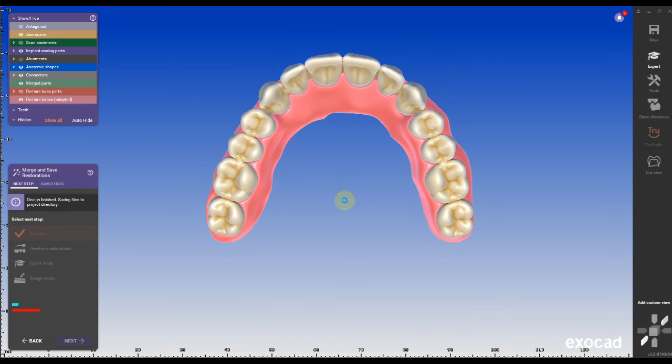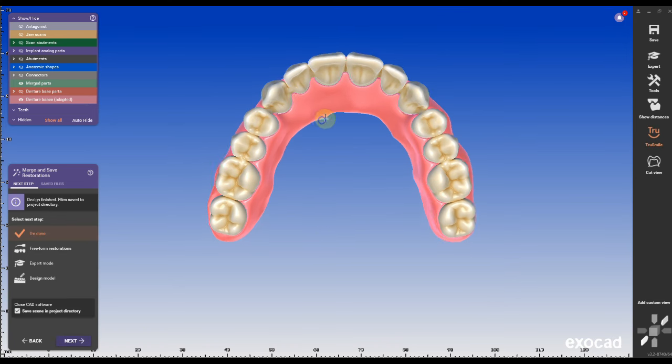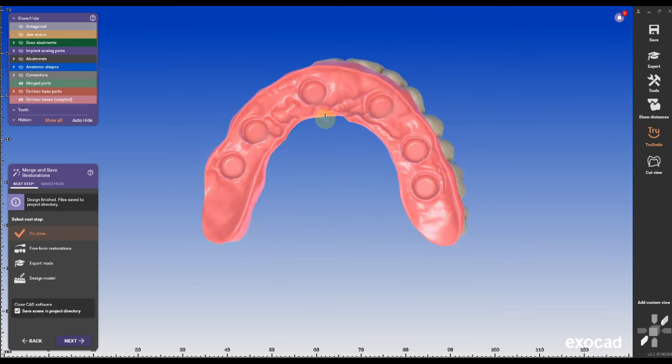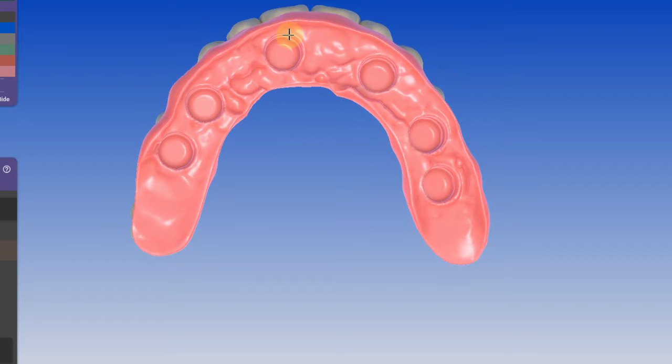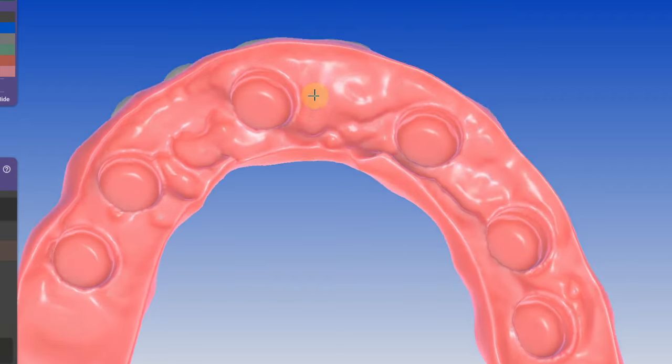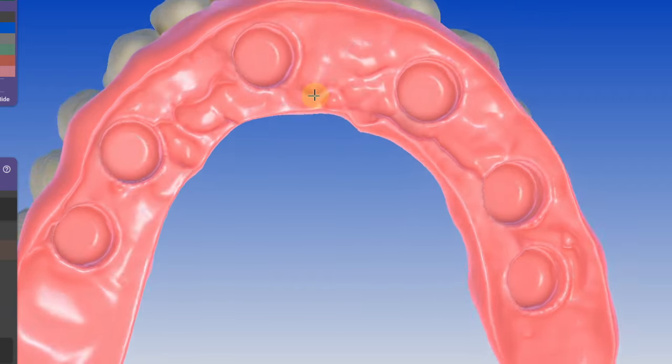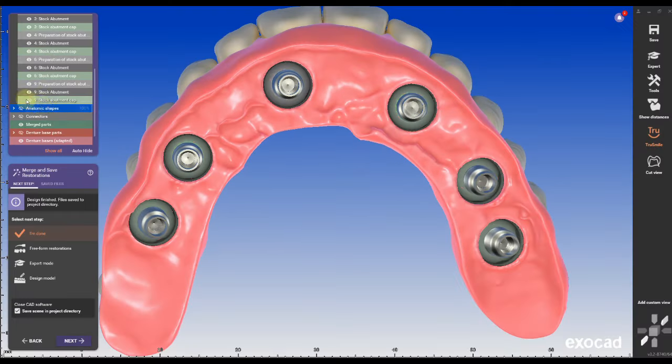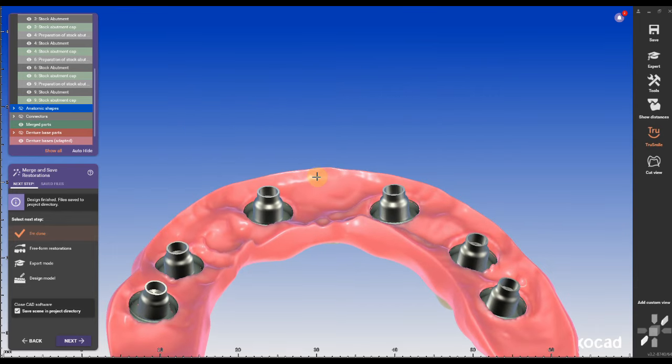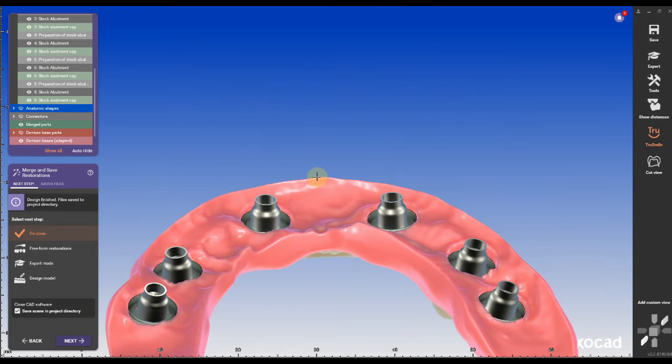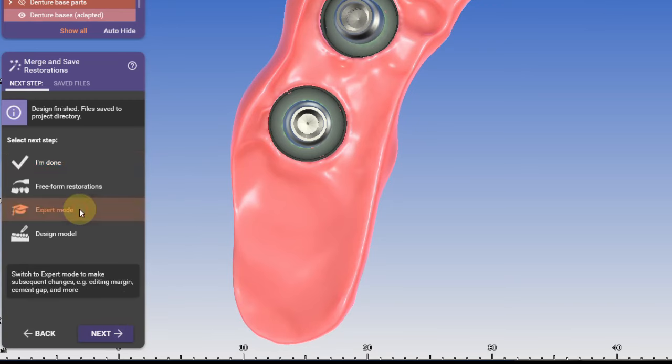This means the basal surface must be convex and not concave. Unlike locator dentures where the patient can remove and clean the dentures themselves, locator fixed restoration can only be removed by the dentist using a special tool.